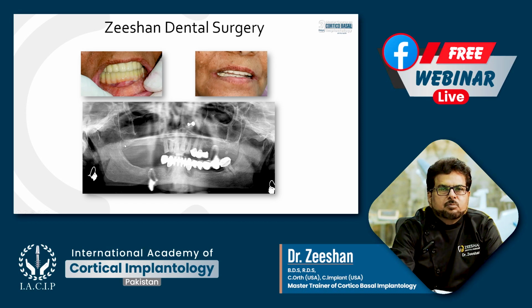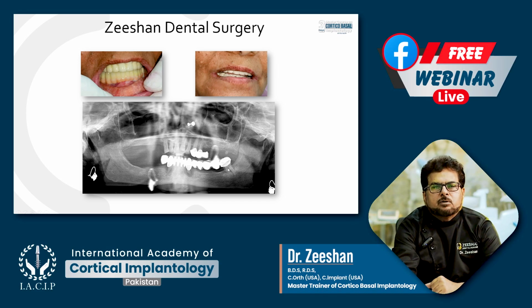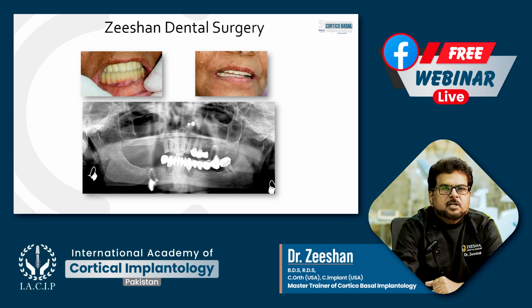You don't have enough bone to place the implants, and the rest of the teeth, even in the lower jaw you can see, all are moving, the bridges are loose, the periodontium is not good, periodontally involved teeth. So we have to extract all these and place the implants. And the patient wants immediate loading, fixed teeth. They want fixed teeth with immediate loading implant placement. They don't want a 4 to 6 month waiting period or 2 or 3 surgeries.